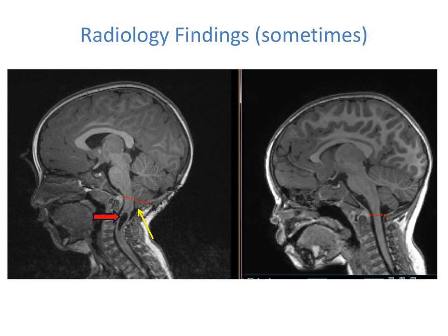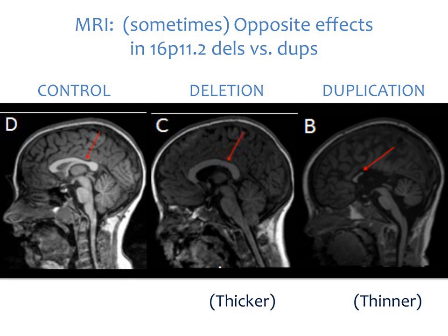One might have an extension of the lower part of the brain called the cerebellum, or a cyst in the spinal cord, as pointed to by the red arrow. Similarly, white matter structures of the brain, this white structure in the middle of the brain is the corpus callosum.